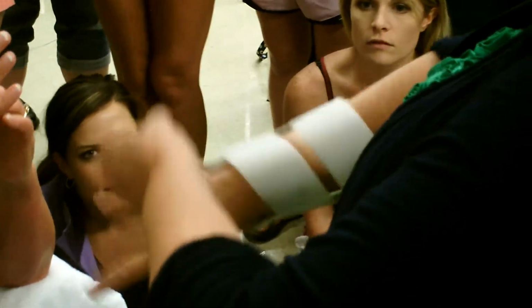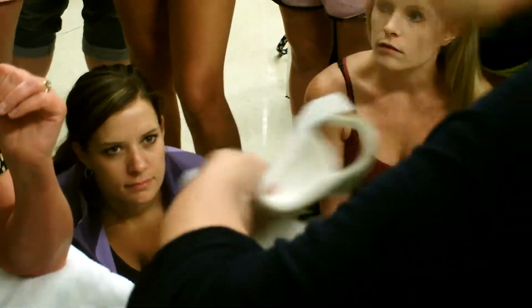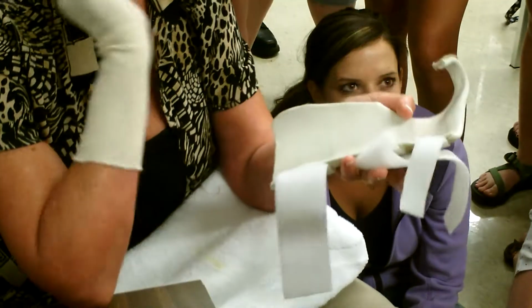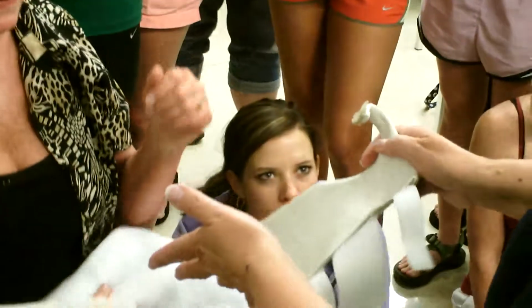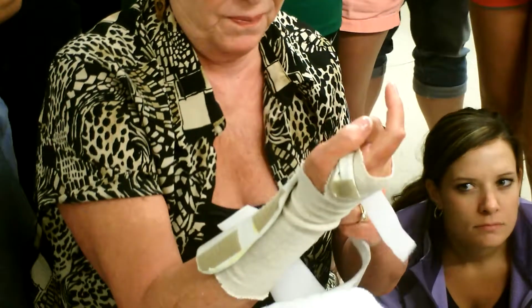Now, this is your splint, and I'm going to have you sit here for around 20 minutes while I work with that patient there, Miss Natalie, and I want to make sure that it doesn't cause red areas. So I don't want you to leave until I check your splint. That's the first thing you do. Secondly, Miss Rita, you can take this off and wash it. Put it on yourself. I want to make sure that you can get it on and off yourself.